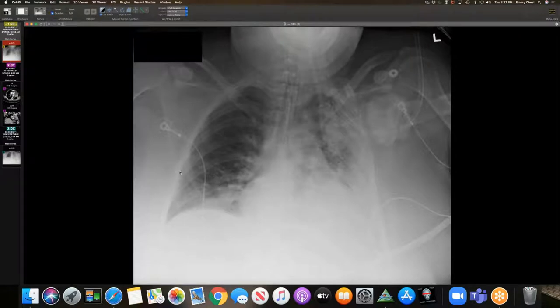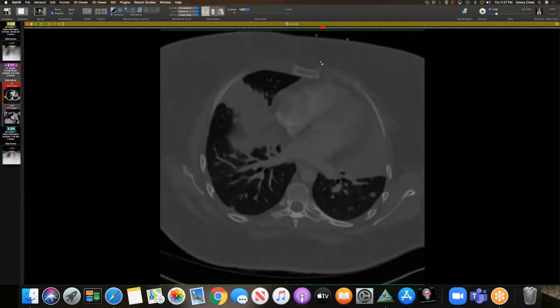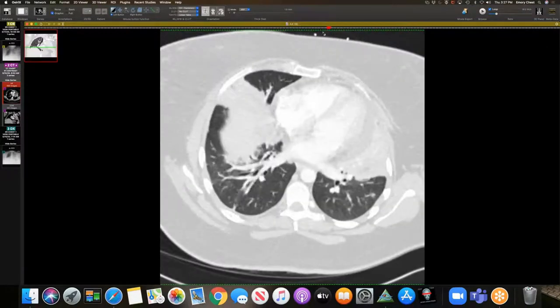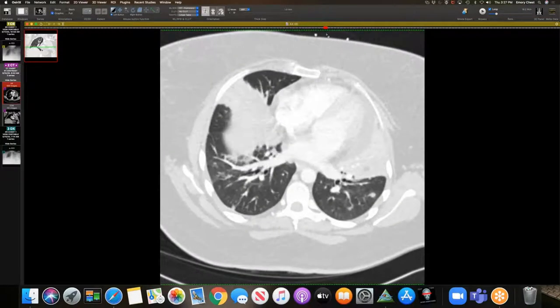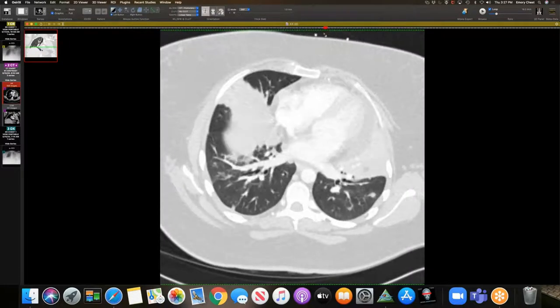So, Peter, there's nothing on the imaging that looks like the COVID part. I think maybe the COVID's in her nose and the MRSA's in her lungs. I think that might be true. What do you think about these nodules? Do you think those could be organizing pneumonia focally? I think that's probably part of your MRSA. Part of the MRSA, okay.